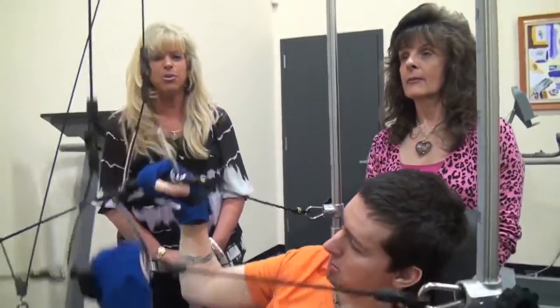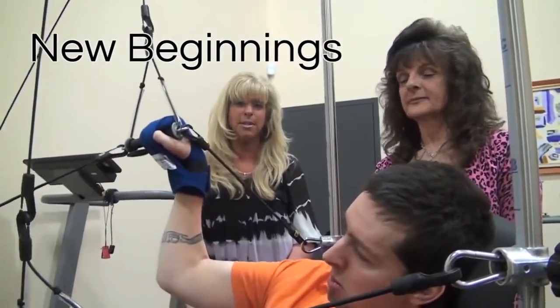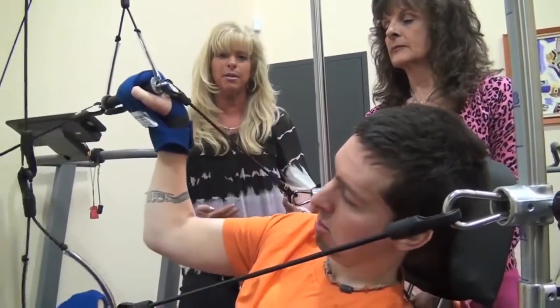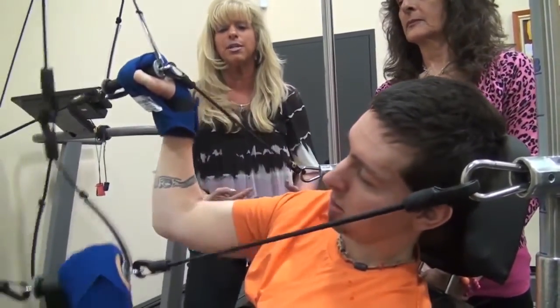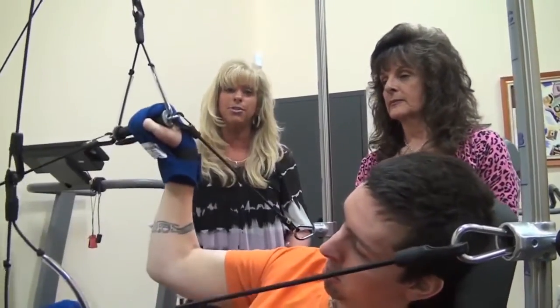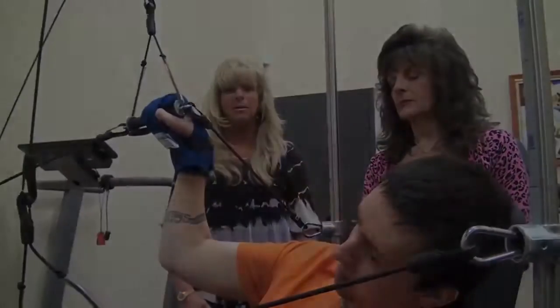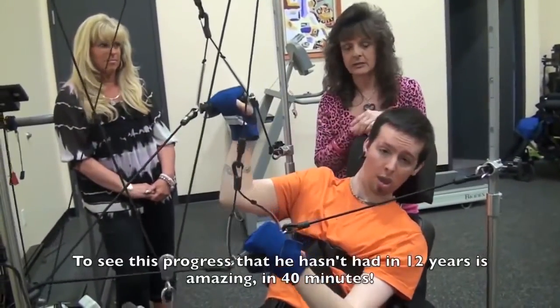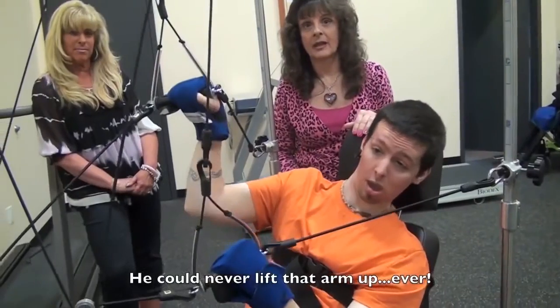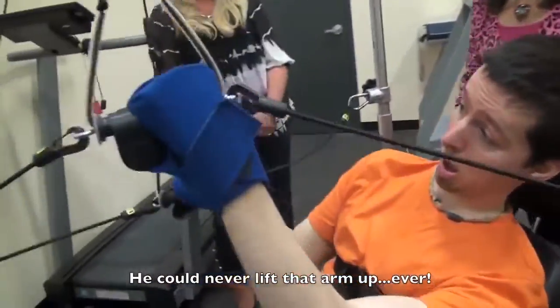During my father's recovery, he would go on the quadricizer twice a day for 60 minutes each time, because it's sort of nature's way to keep the body moving, walking, and maintaining circulation. Those things are crucial in recovery — if you sit in a wheelchair or lay down, your body's not going to heal. You can see progress in 40 minutes that he hasn't had in 12 years. I'm amazed — his arm has opened up even more since 15 minutes ago, and it's higher.